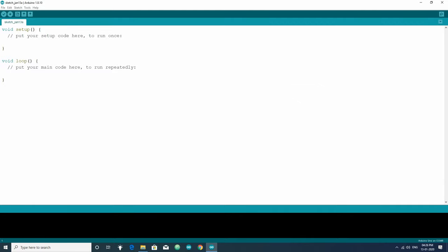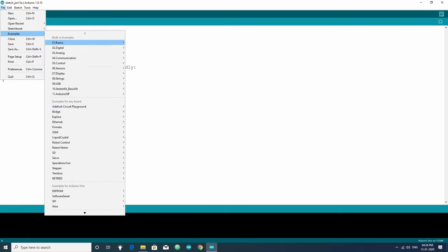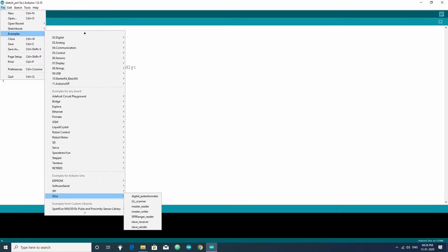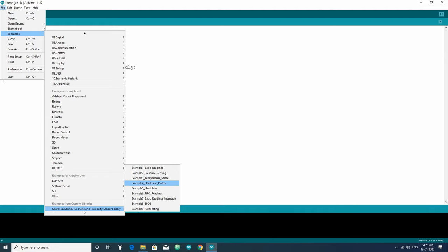Now open the examples provided with this library. Just go to file, examples, SparkFun MAX3010x. Here you will find sketch to get the basic readings from the sensor, to detect object presence, get module temperature sensor data, get heart rate, get oxygen level and much more.